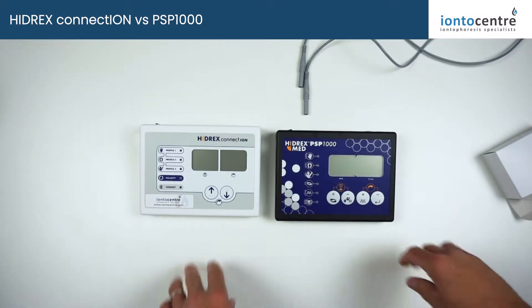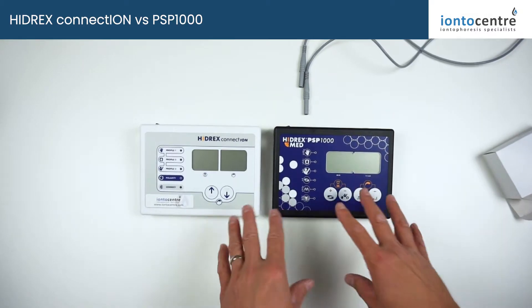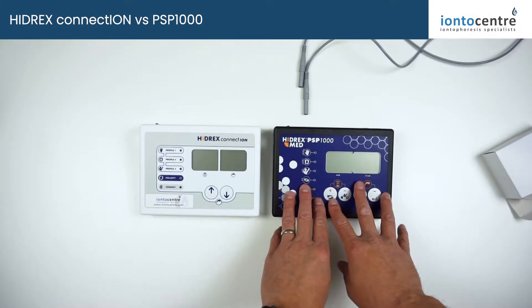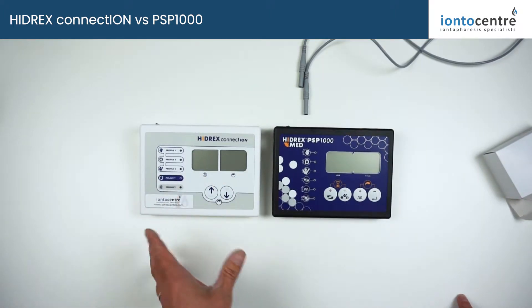Coming on to the control panel itself, just to highlight some of the main and key differences between the old PSP1000 and the new connectION. They've simplified the control panel to make it a little bit less confusing.